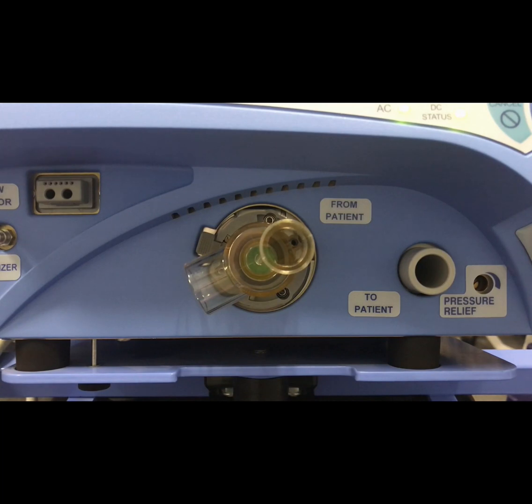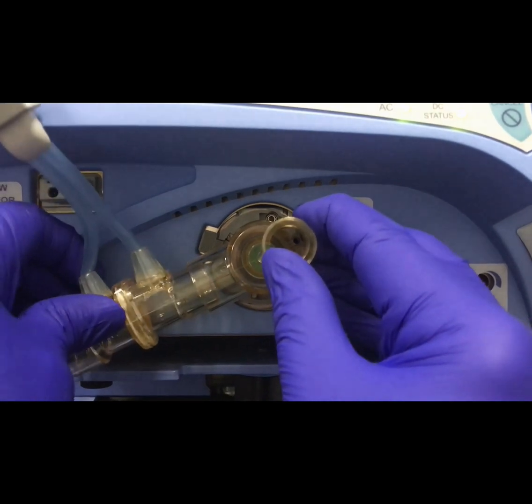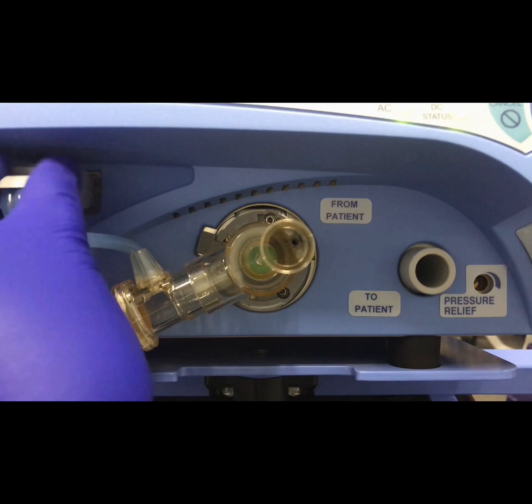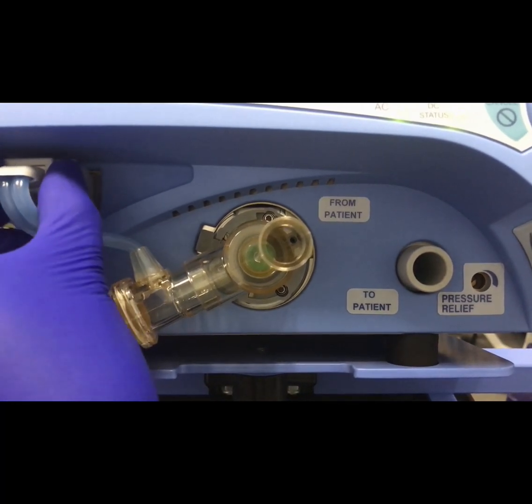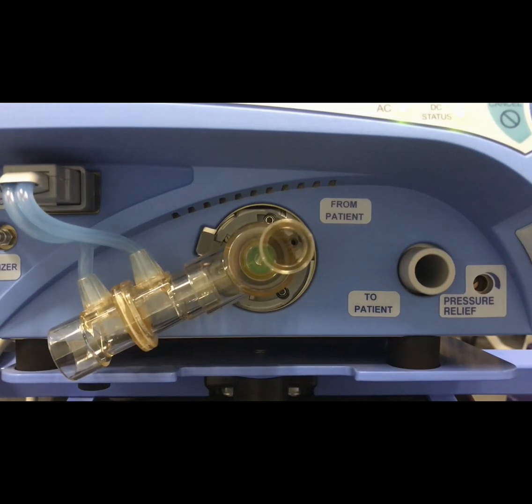Finally, we'll attach the expiratory flow sensor by inserting it into the side port on the exhalation valve body, and then attach the sense lines to the front of the ventilator, making sure to retract the locking collar before inserting the connector, and then confirming it's locked in place with the collar forward after attachment.